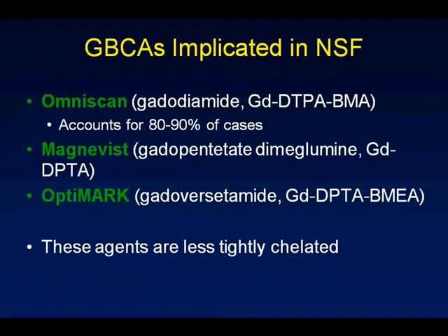So as mentioned, certain gadolinium contrast agents are implicated in NSF. And as mentioned, these are the ones that are less tightly chelated: OmniScan, Magnevist, and OptiMARK. We were using OmniScan, which is why there was one patient locally who was affected with NSF. Fortunately for us, at the time NSF was emerging, our contract with OmniScan was finishing, and we were trialing MultiHance, so it was fortuitous that the timing was right, that we were basically done with OmniScan and we moved on to MultiHance, which has not been implicated in NSF so far.